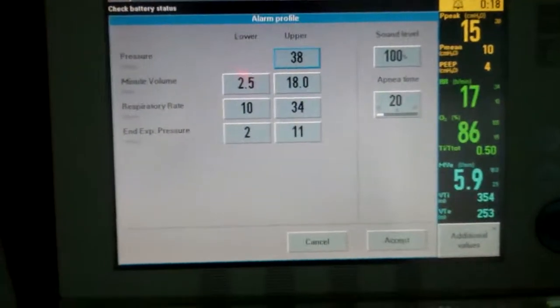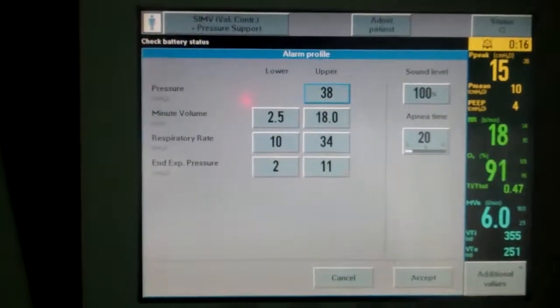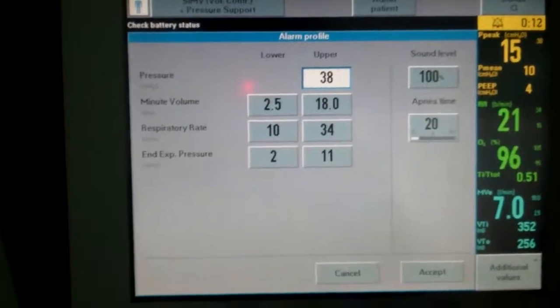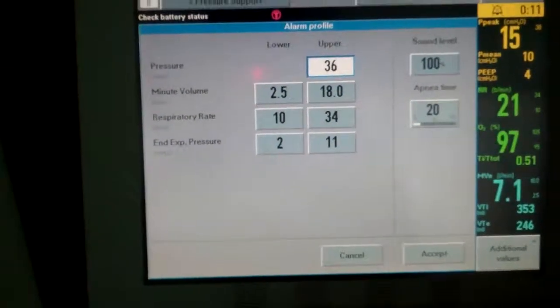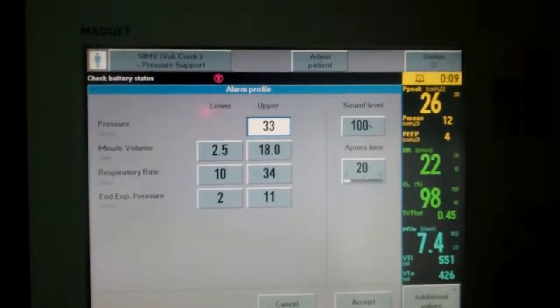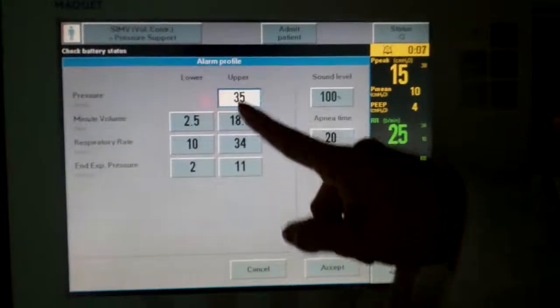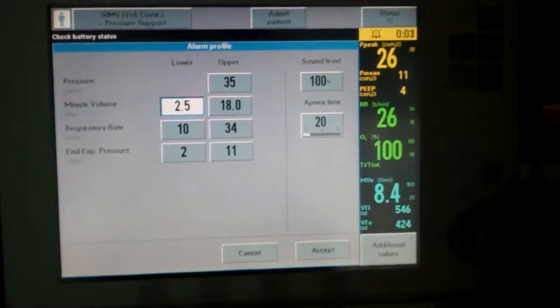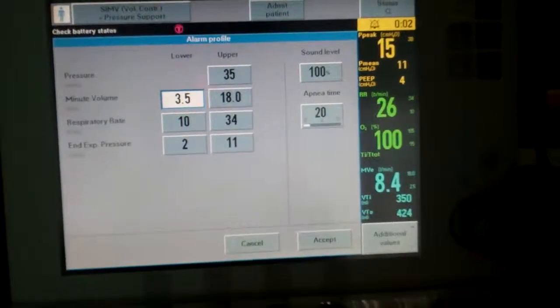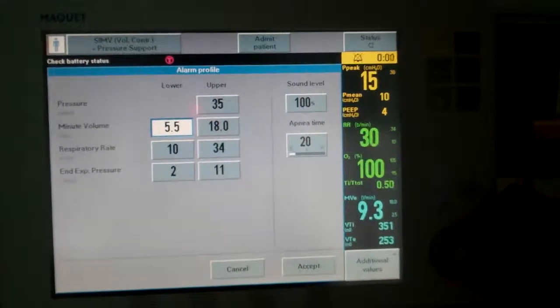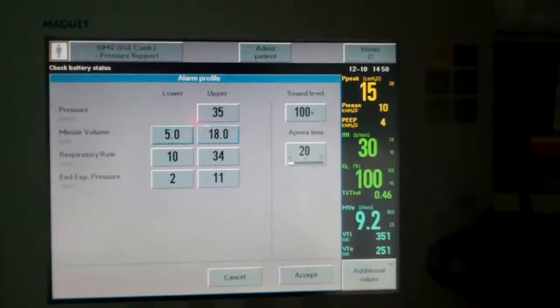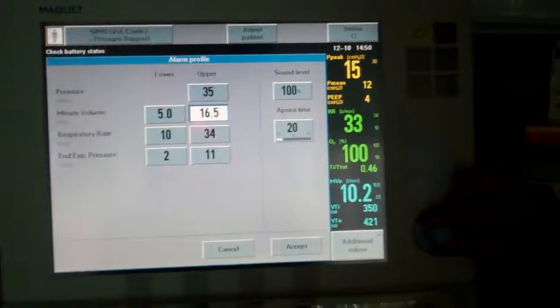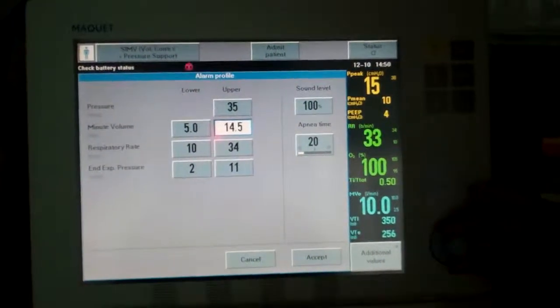At this time, it is important to set your alarm settings to make sure you get alarms when the patient is asynchronous or there is a problem such as increased airway resistance or decreased compliance. You want to make sure your patient is in sync with the ventilator. And that's pretty much how to set up SIMV. Thank you very much, and have a nice day.